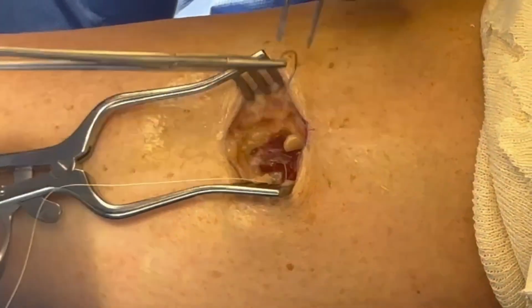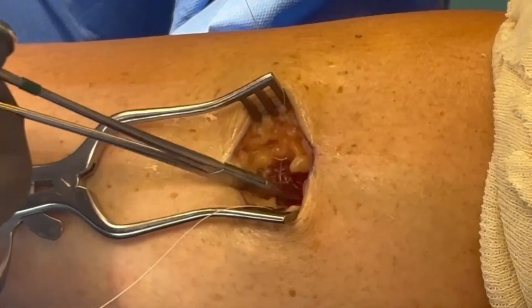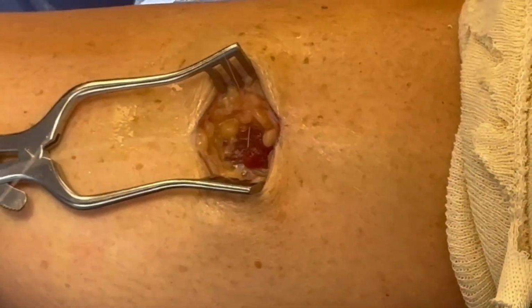If you don't close this, the muscle will herniate out the side of the leg when the patient walks, and it looks odd. So it is important to close this layer.